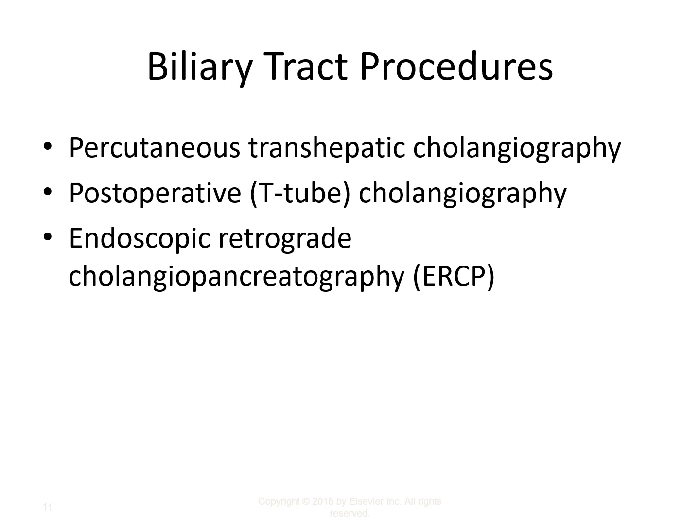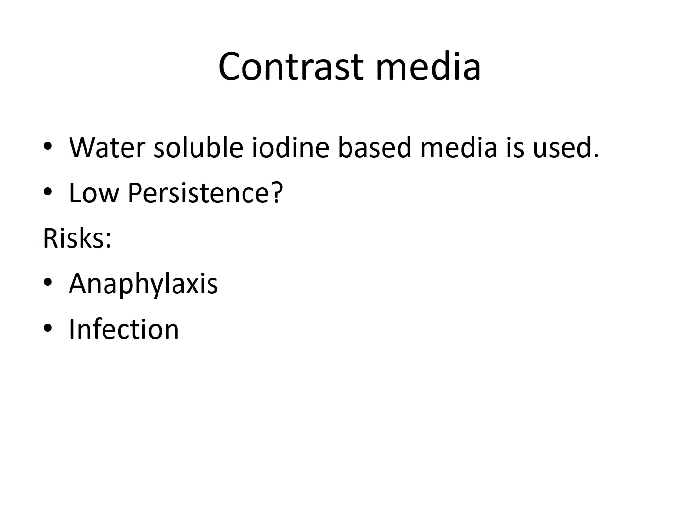And then the last one, endoscopic retrograde cholangiopancreography. That involves the patient being sedated and an endoscope being placed through the esophagus, through the stomach, through the small bowel, and then cannulate the biliary duct with a catheter at the tip of the endoscope. And that's usually a fluoro-assisted procedure. Water-soluble iodine contrast-based media is used.